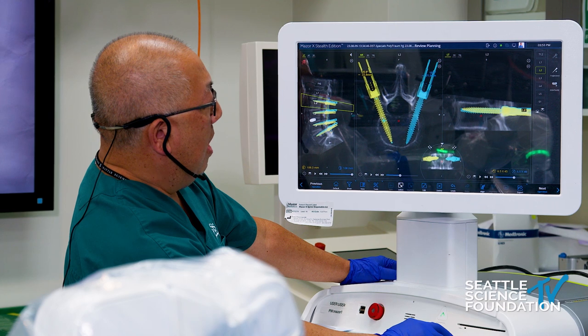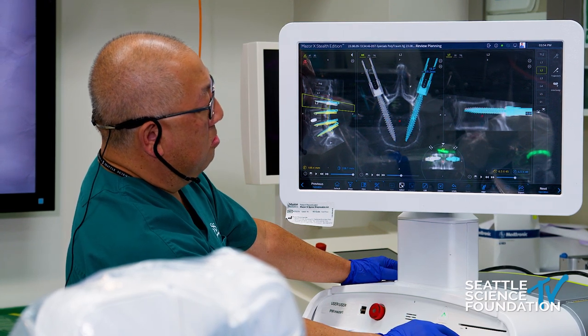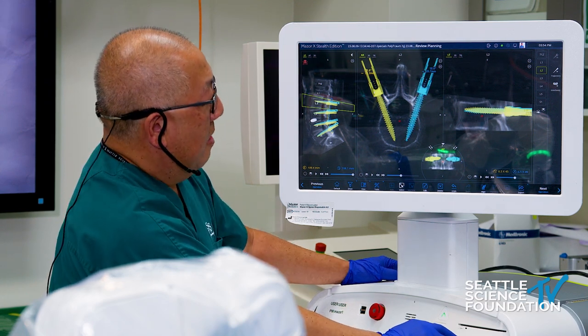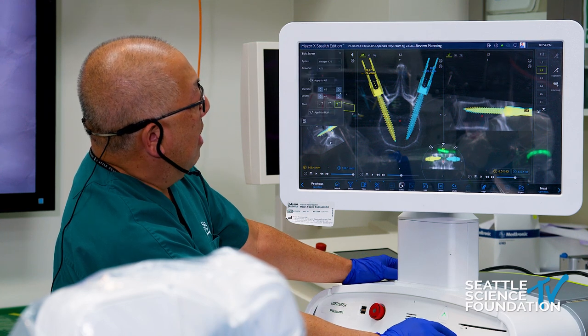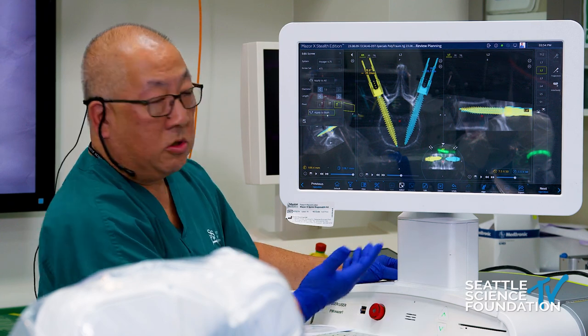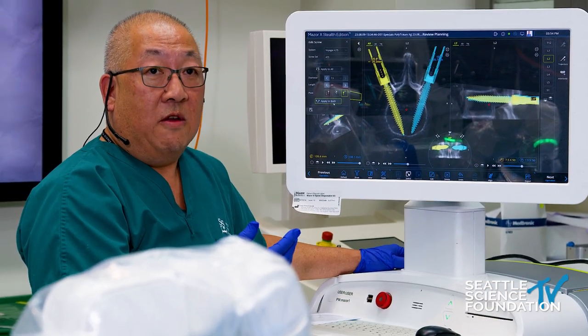I just do a drag and drop with my mouse and I'm going to plan a couple of screws at L2. I keep in mind the facet joint and try to avoid it, putting that nice perfectly planned screw. If I want to change the length, I right-click. I can go up in diameter, up in length, and apply it to both screws very quickly. Planning is very nice — it's very efficient.